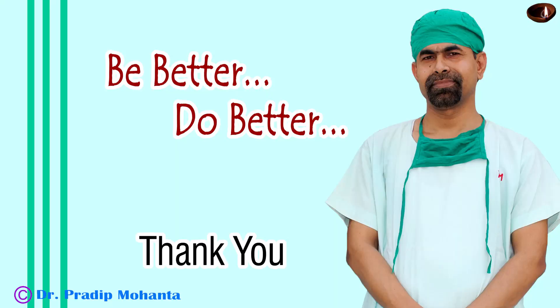Thank you very much for your attention. Hope this video will help you in developing your surgical skills. This is a real-time video. Be a great surgeon and serve your patients with love, respect, compassion, and great surgical skills.